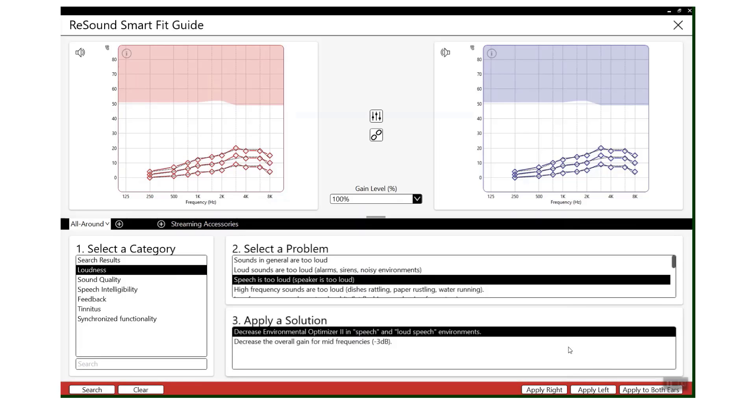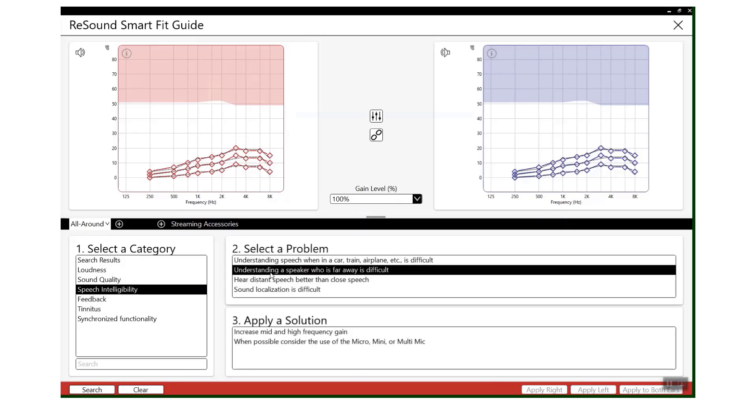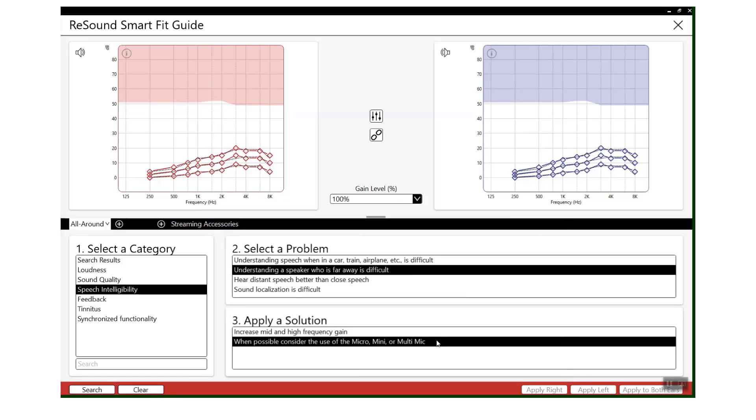If, for example, you have a speech intelligibility issue, by clicking on a certain problem it will also advise where appropriate if an accessory should be used - for example, consider the use of a remote microphone.